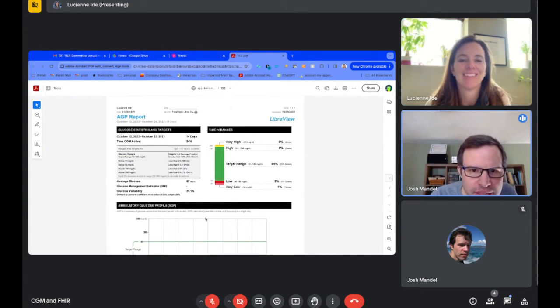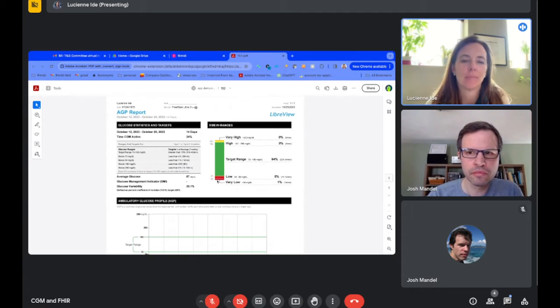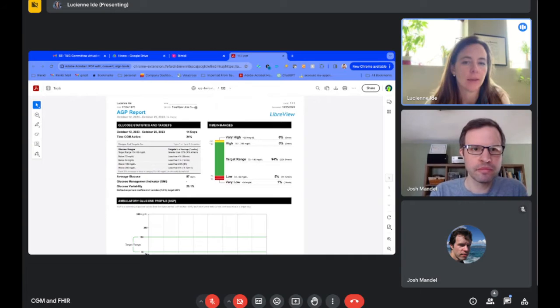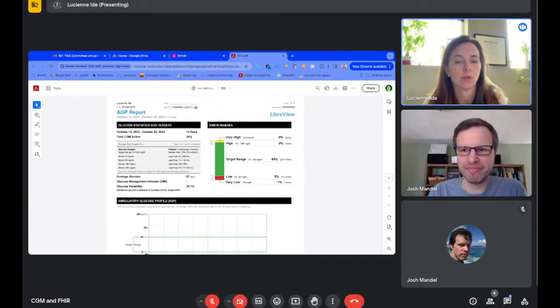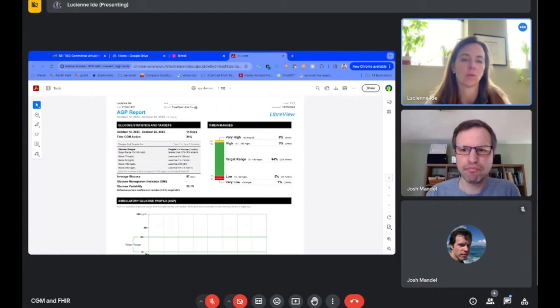But in range, less than 180. Okay. Yeah. And again, these are standards. These glucose ranges here in the gray box on the left. Yep. Those are as defined by guidelines, right? Yep. So this is not Abbott making decisions about how to summarize. It's not Abbott, and it's not the patient setting their own range, which in Libre 3 you can do on your app, and the provider can update that. But these are the standard guideline-based ranges.